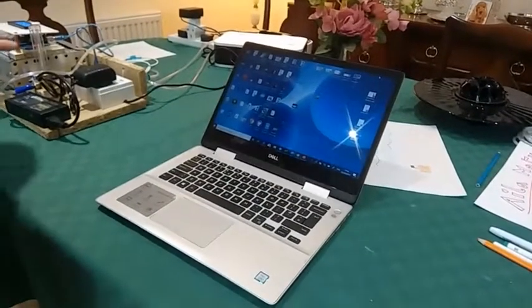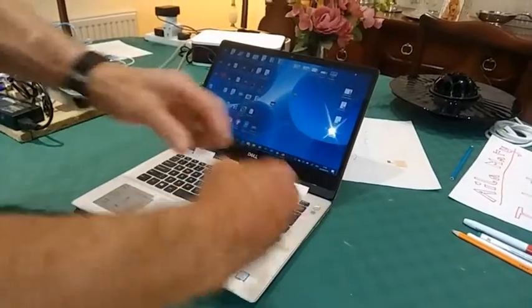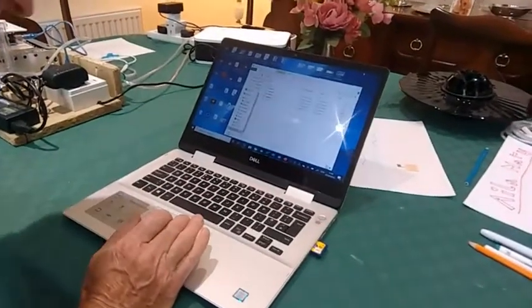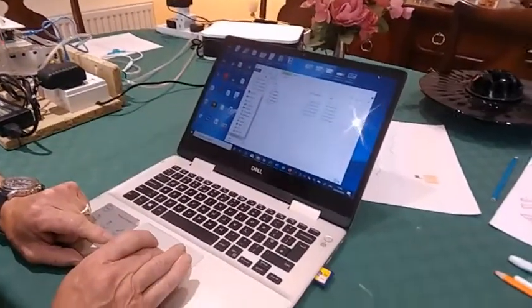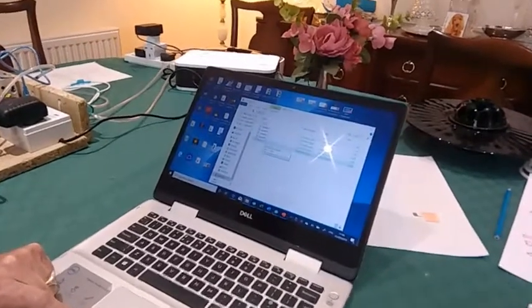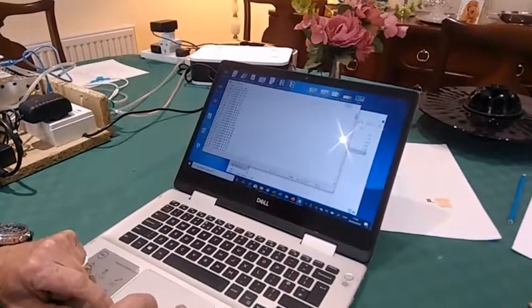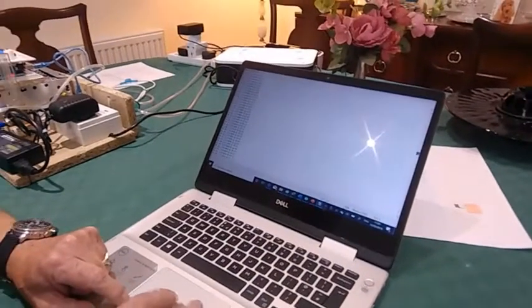The data can be read from the SD card onto the computer. The machine data can be documented with an ID specifying which file, and this shows the data that we were collecting during the demonstration.